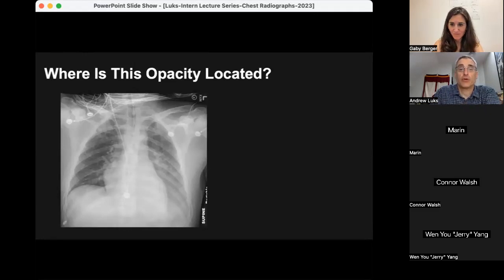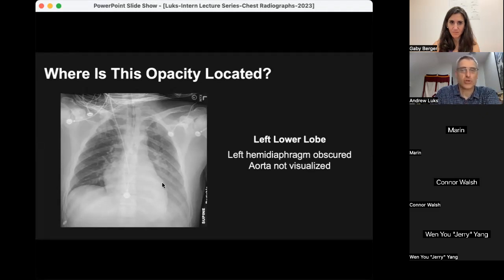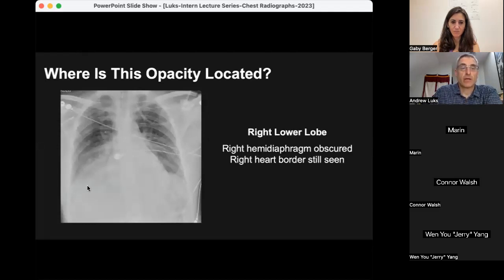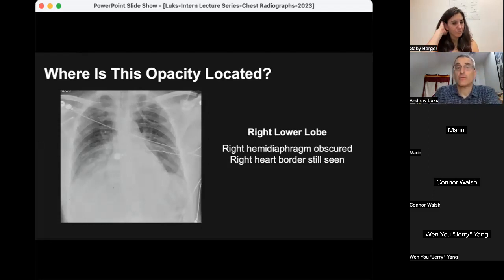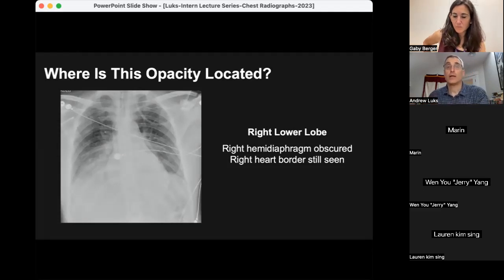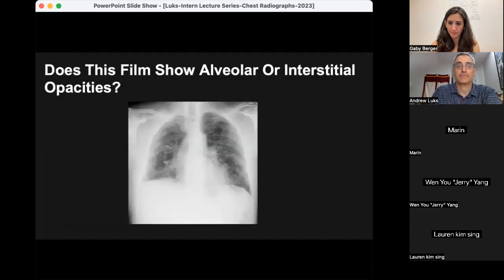Left lower lobe is correct — notice you can't see the descending aorta and you don't see the left hemidiaphragm at all. And here's an example of a right lower lobe opacity: you don't see the right hemidiaphragm, but despite the opacity in the right lower lung zone you can still make out the right heart border, confirming the middle lobe is not involved. The location of an opacity plays into your differential diagnosis — for example, lower lobe involvement might suggest aspiration pneumonia — and it also affects where pulmonologists would perform bronchoscopy.